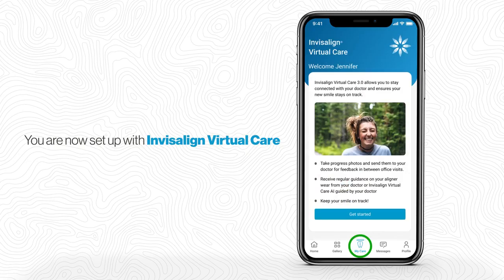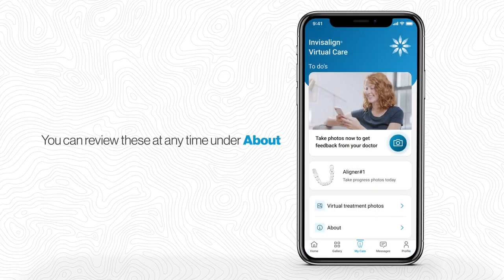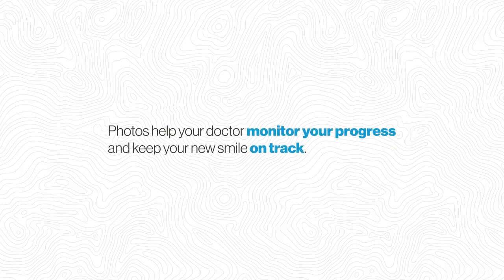When you initially click on the My Care tab, you will see a short welcome overview and will also be able to review the detailed instructions of use. You can review these at any time under the About tab. With each aligner change, you will receive a notification from the My Invisalign app to take progress photos using the Invisalign lens. Remember to enable notifications, as these photos will help your doctor monitor your progress and keep your new smile on track.